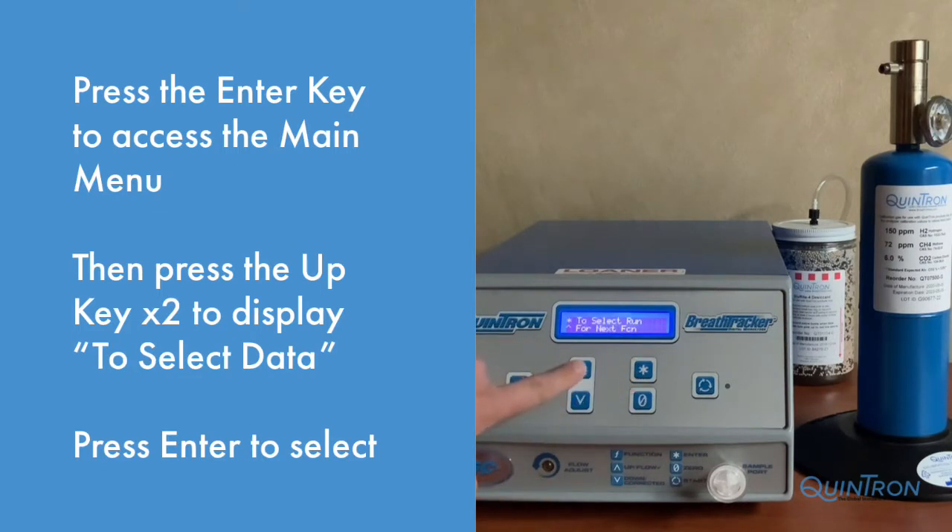Next, press the Up key twice until the display reads to Select Data. Press the Enter key to access.